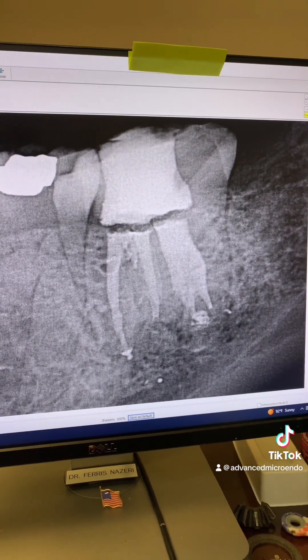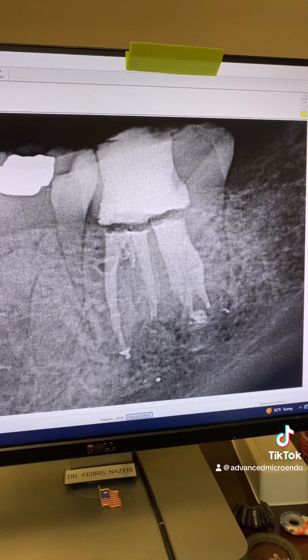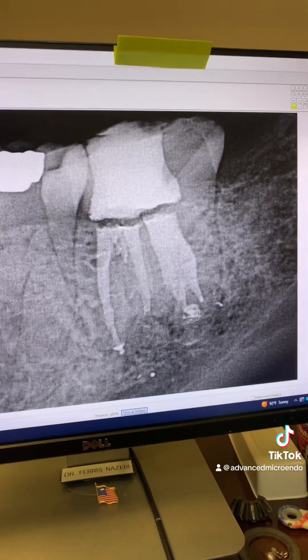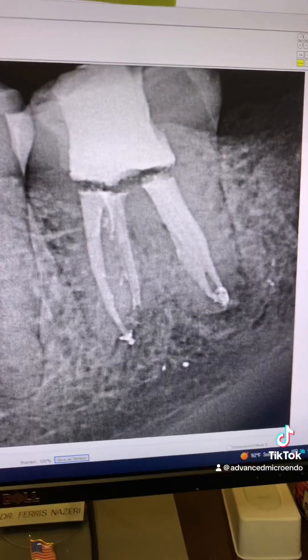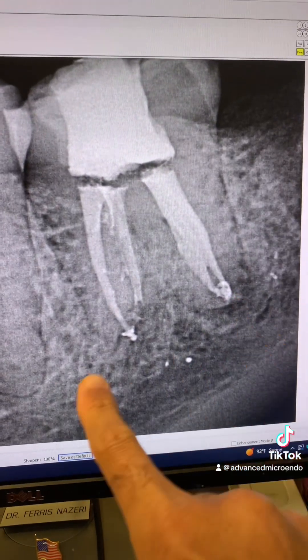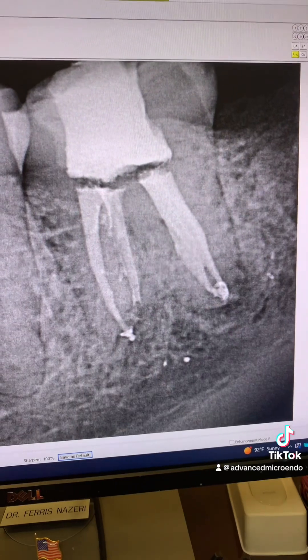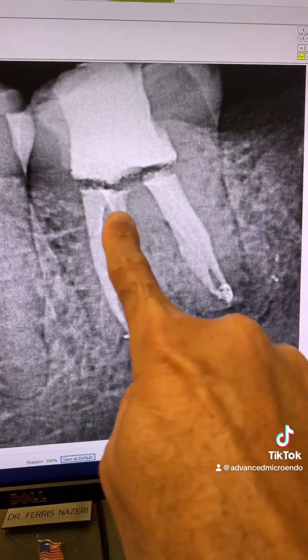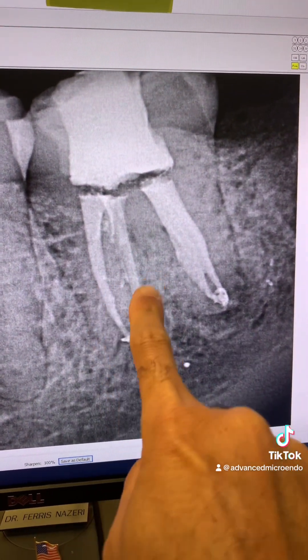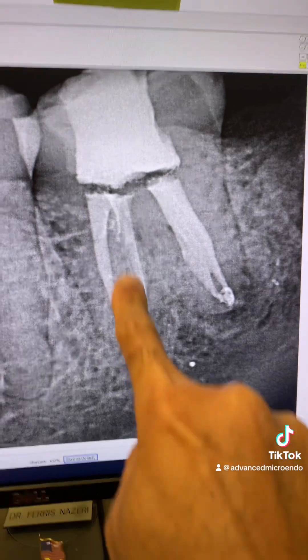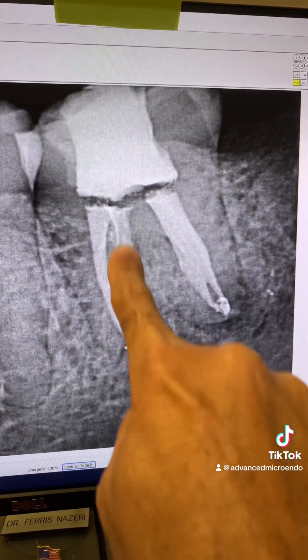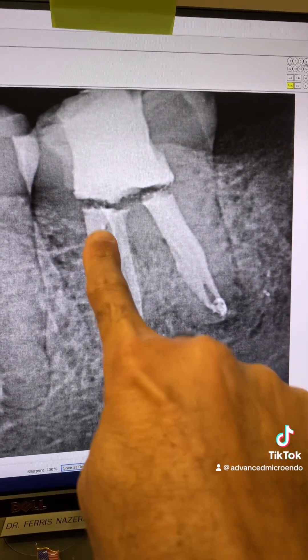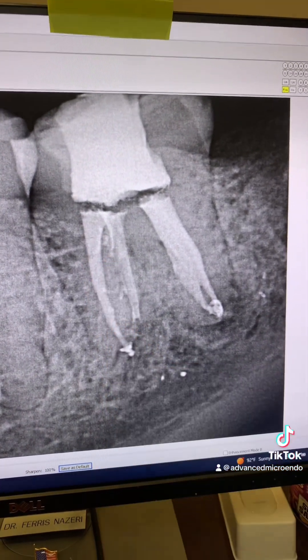All right, so — very good. This is another angulation and you can see all of this anatomy here. Look at all this anatomy, all this anastomosis between the mesial canals.